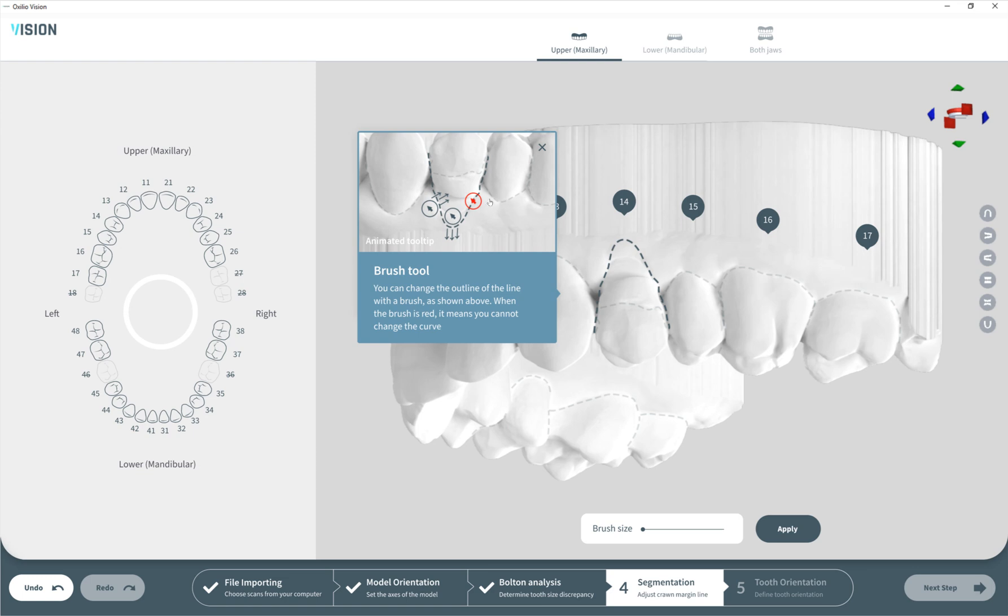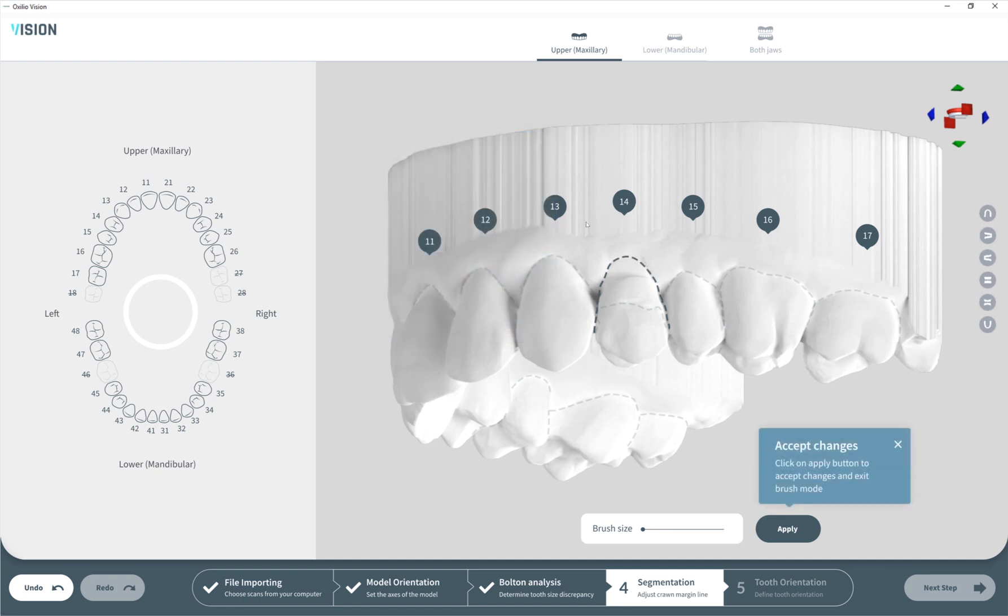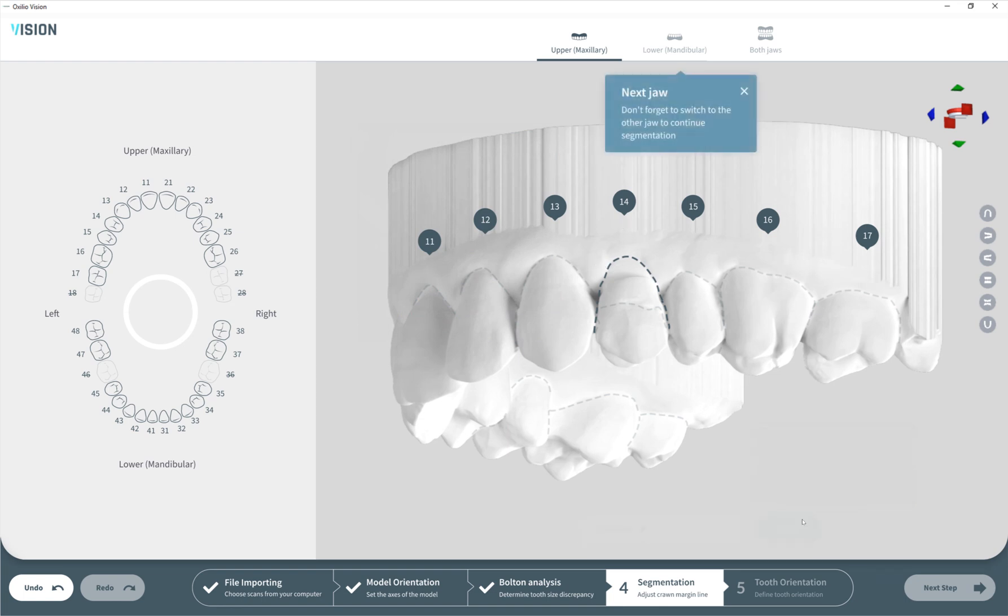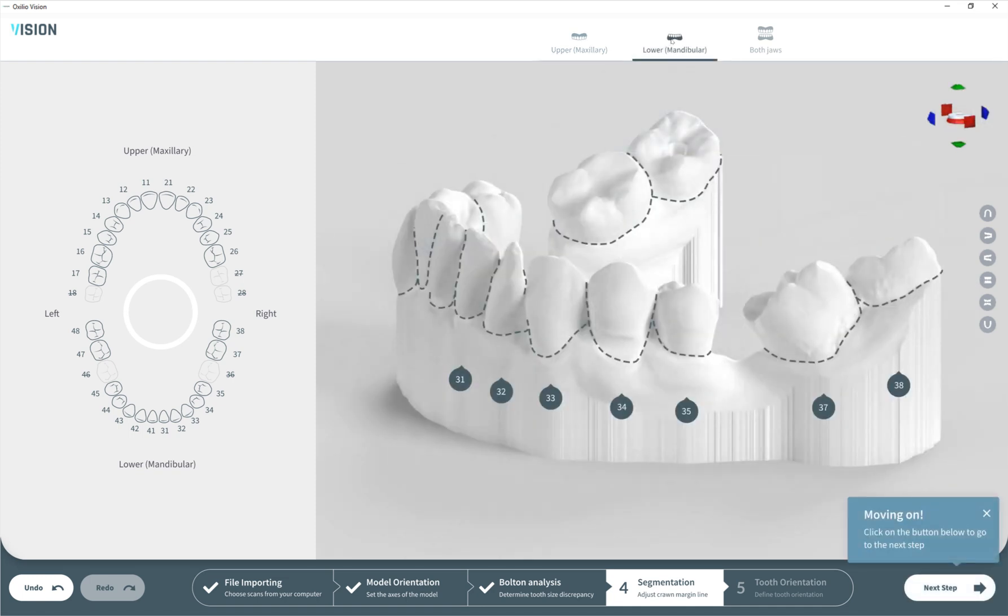It's not like in other software - we're not sure this will be implemented in the final version, but we find it very handy and nice. Of course you can change the brush size. After completing the correction, you hit apply which brings you back to the mode where you can select other teeth. You can go to the other jaw and switch between them in the upper side. We have these nice helpful circles pointing where each tooth is.